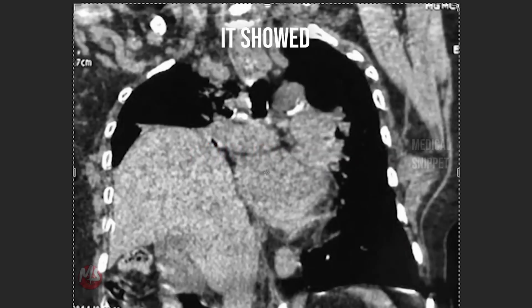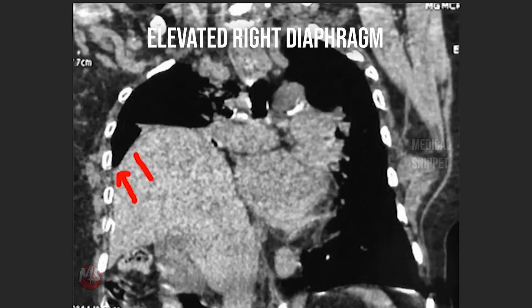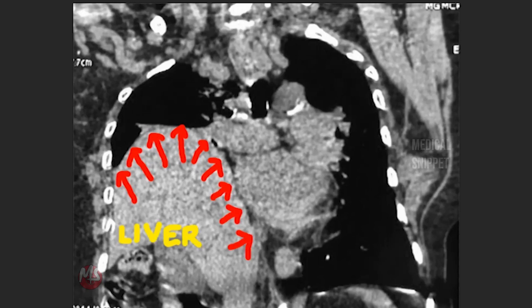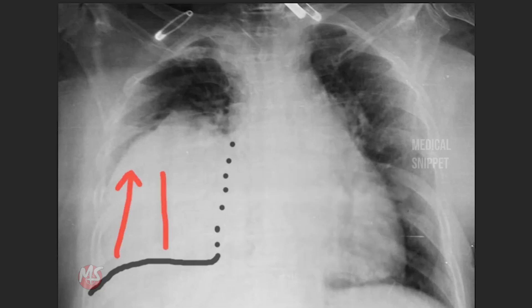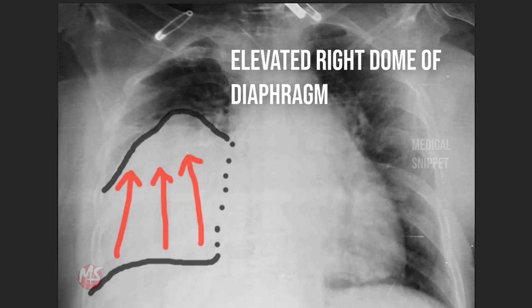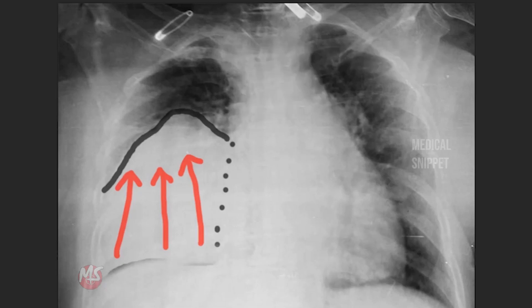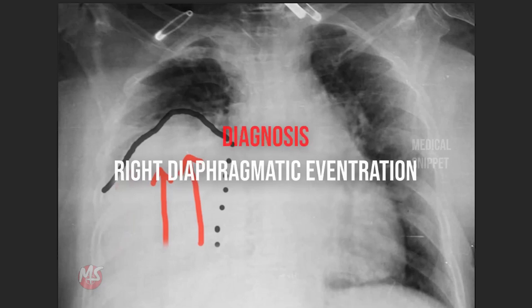To differentiate between these two things, we did a CT thorax. It showed elevated right dome of diaphragm. Looking at the chest X-ray again — this is the assumed normal position of the diaphragm, this is the right heart border, and this is the elevated right dome of diaphragm. So it confirmed this is a case of right diaphragmatic eventration.